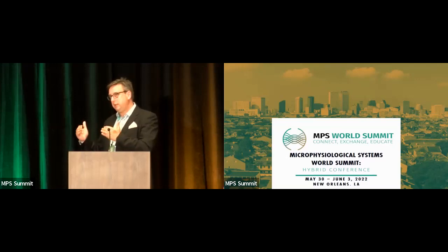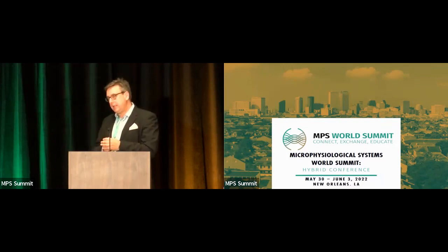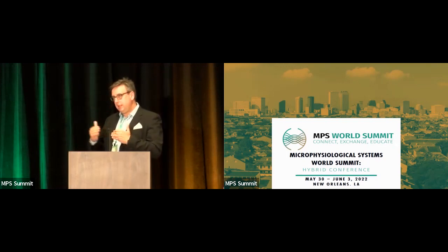But on the other hand, a big benefit is that our calculated index is continuous. So we're not just looking at like 5 classifications, 1 to 5, but we can also have a much more granular assessment. And I think this will be crucial to see these fine changes that some of the pharmaceutical interventions will entail.